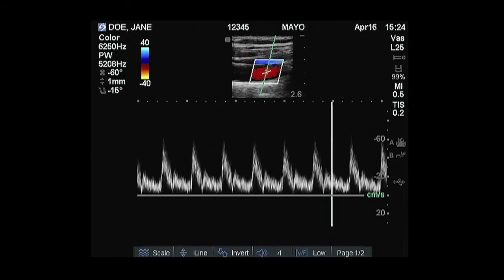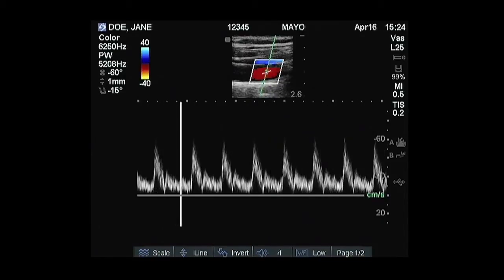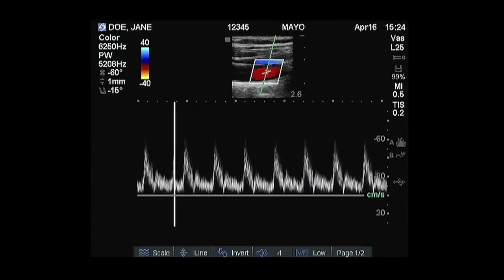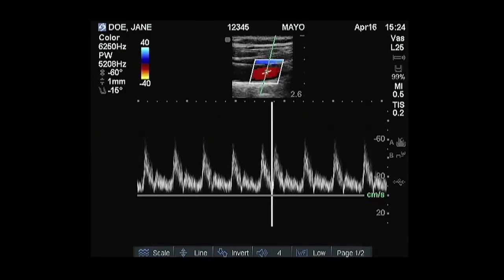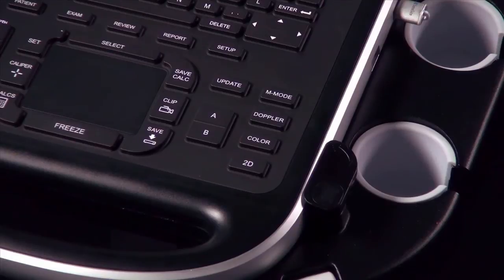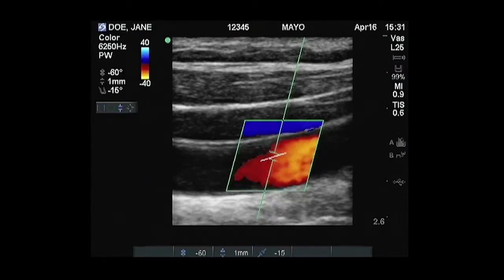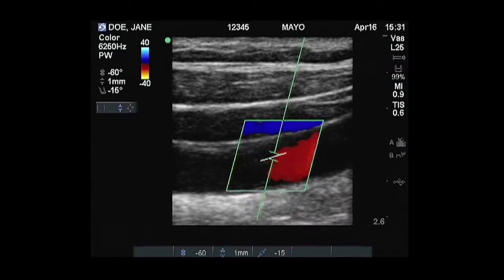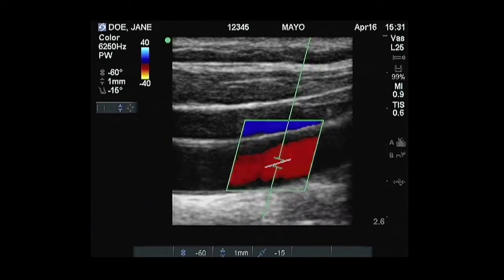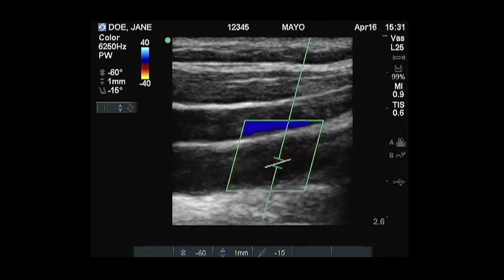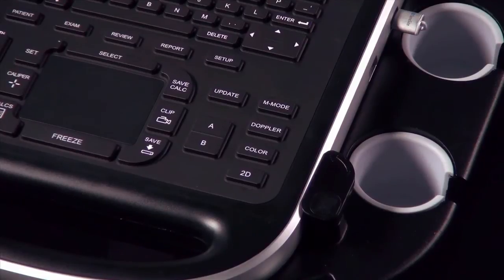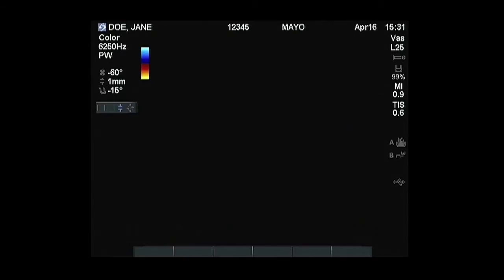Color Doppler may be used to quickly identify where blood flow is located in a structure. Pulsed wave Doppler may be used to detect and measure the velocity of blood flow through a vessel. To activate pulsed wave Doppler, press the Doppler key. A Doppler sample line will appear. Use the touchpad or arrow keys to place the sample line in the blood vessel. Note that the color ROI box is tied to the Doppler sample line. Press the Doppler key again to activate the Doppler spectral trace.